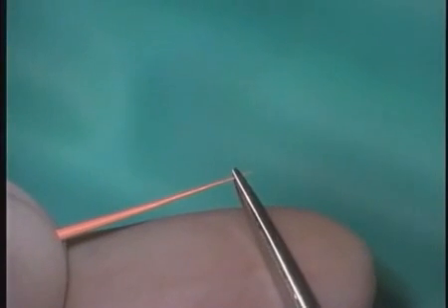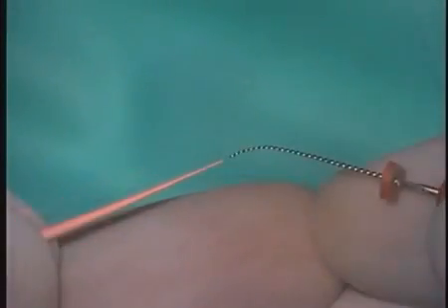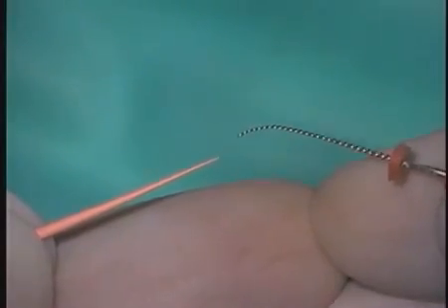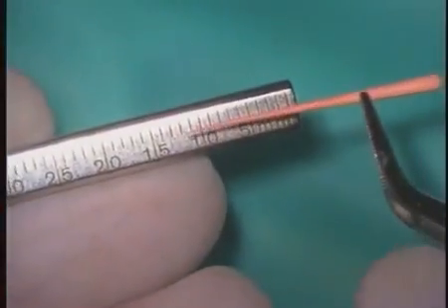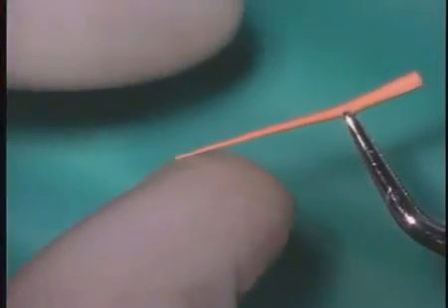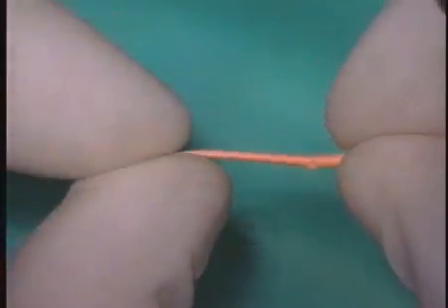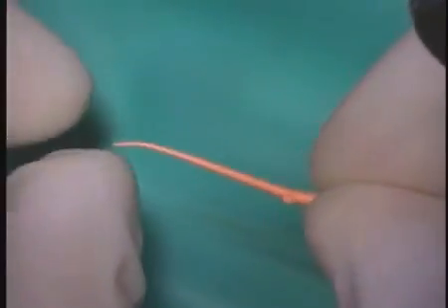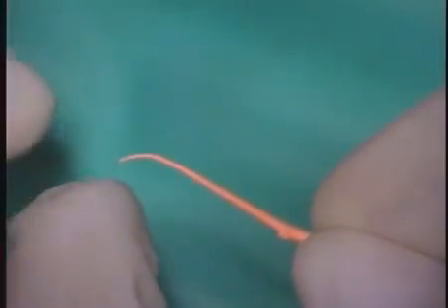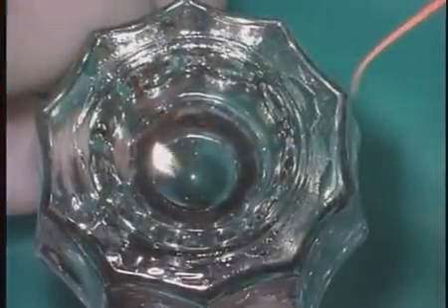In these instances, we trim the master cone so that it corresponds to the last file that was snug apically. The master cone is measured in the typical manner. We will notch the cone not only to know the vertical extent of working length, but also we'll curve the cone, and the notch will be oriented to be directed with the curvature of the gutta-percha point. This way, when we introduce this cone, we can kick it past the ledge.